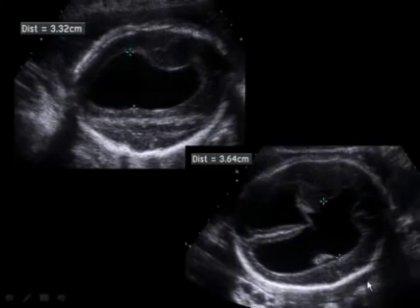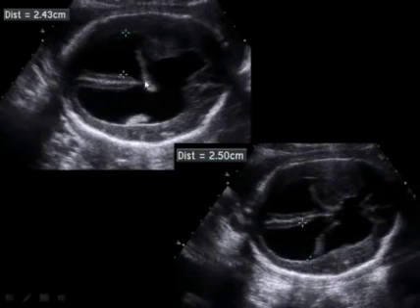Here's the same fetus in the down ventricle, and we have also artificially increased the size of the ventricle to 36 millimeters because we've crossed the midline, and this is at least part of the third ventricle and possibly part of the up ventricle that's being measured as well. More accurate measurements for this fetus: the falx is right down in the midline, and we're back in the atrium, and we have a measurement of 24 millimeters.